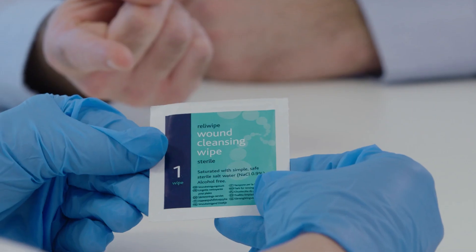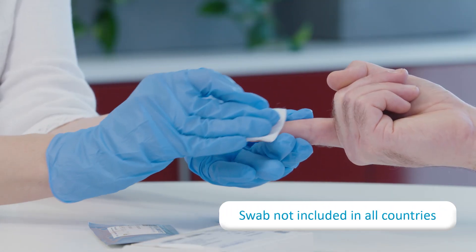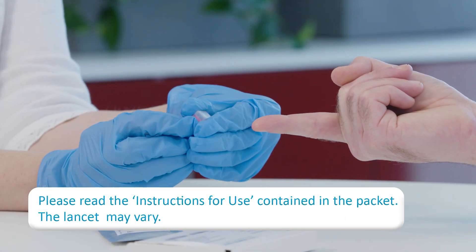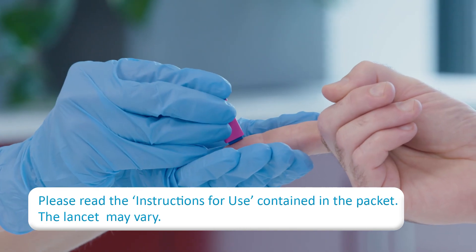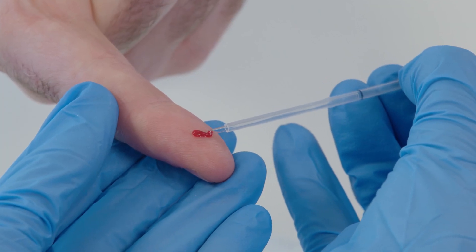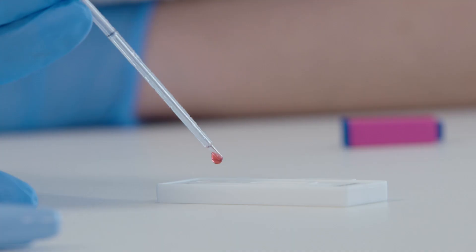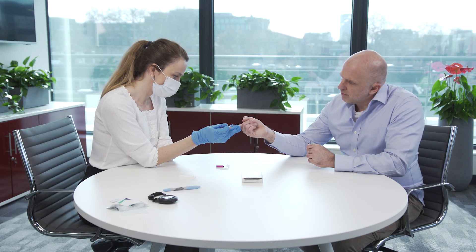Open the cleansing swab and cleanse the subject's finger with the swab. Next, remove the protective cap from the lancet and use the lancet to draw fingertip blood. Use the pipette to draw two drops — 50 microlitres of blood — and place them into the specimen window S on the test strip cassette.